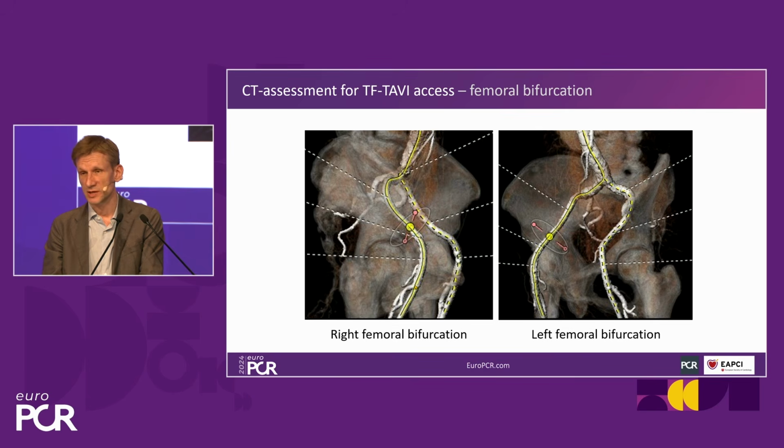Here, it's a nice patient with a very low femoral bifurcation. Right side, there is some circumferential calcification there, so I want to avoid that. But here, I could say, well, I'm going to puncture mid-femur head. So that's my study on my CT. Right side, there are some things I exclude.